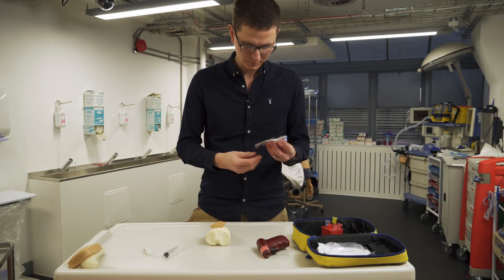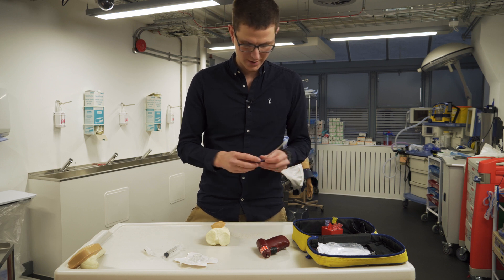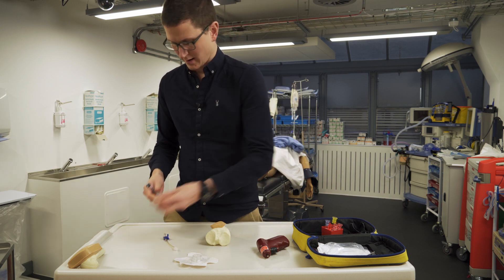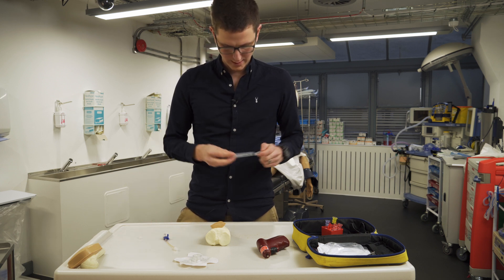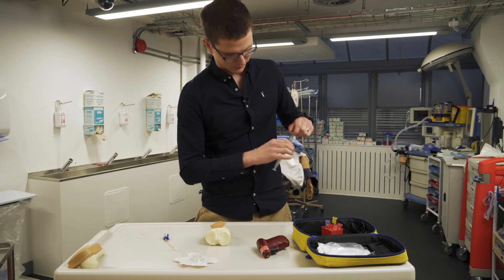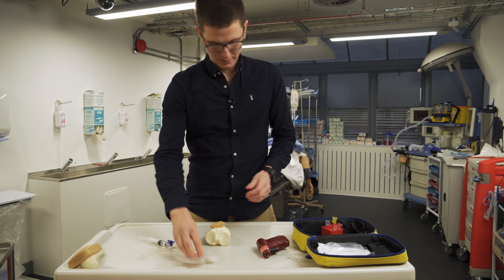So what is the process? First, we need to get all of our kit. Like usual, we have to prepare - preparation is key. So we have our three-way stopcock, our fluids, our flush, all these things. We need to make sure we have everything ready, prepping everything, flushing everything. And we have our tie down ready.